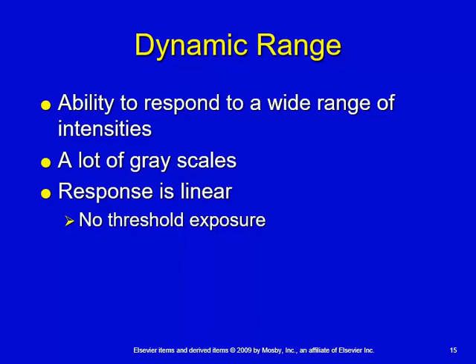So what we had with a film like this was that our film went from a very light exposure to a very dark exposure rather quickly. And what that did was it gave us very high contrast. And so if we had a structure where we had a wedge shape, like the foot or the T-spine, then what we had was a structure that we couldn't see both ends of the structure well.